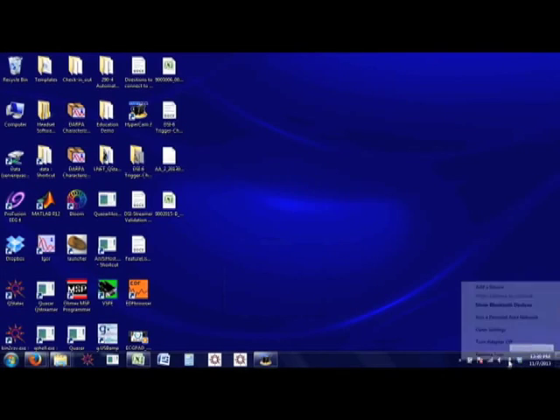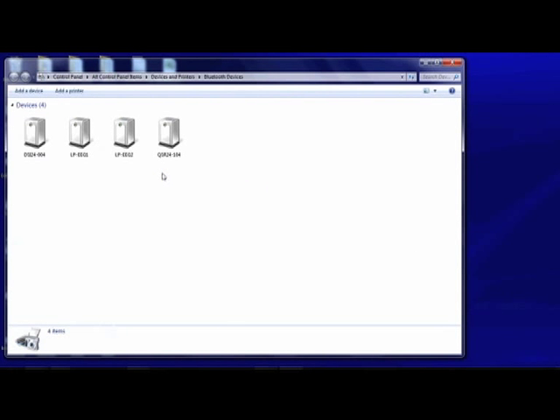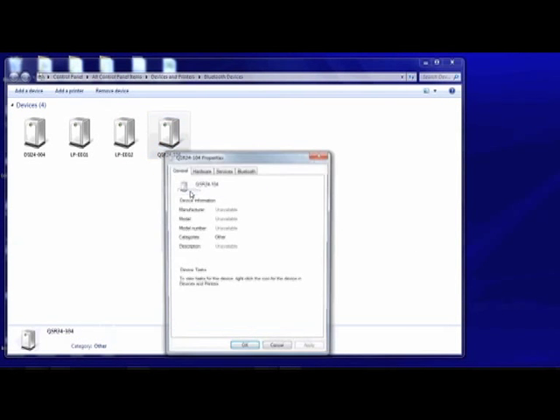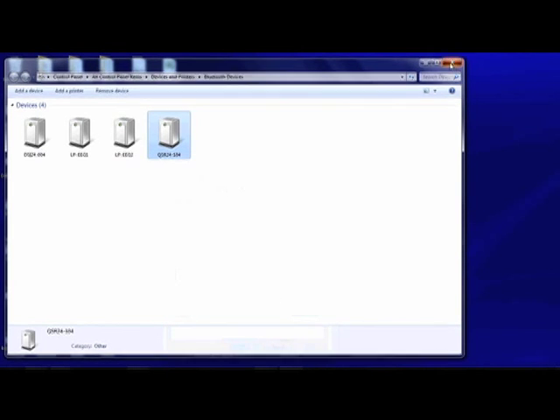To determine the port to which a headset has connected, open the Bluetooth devices menu and view the properties of your DSi system. Under the Services tab, you will find the assigned COM port number. Note the number and close these windows.